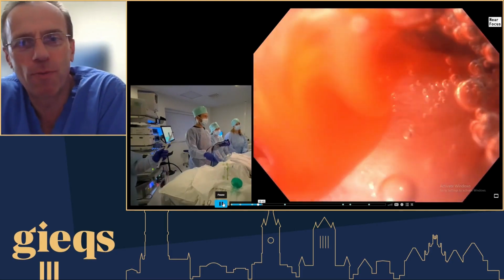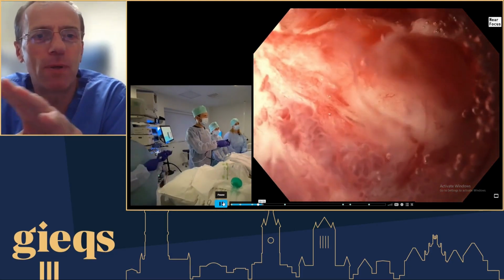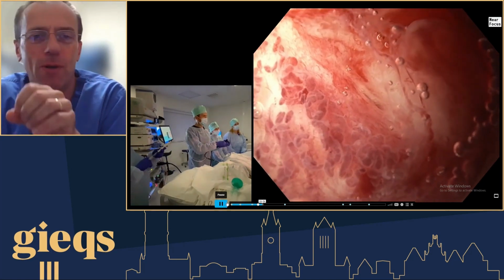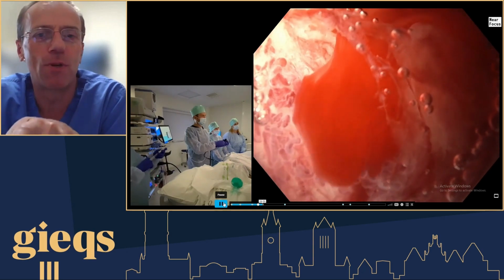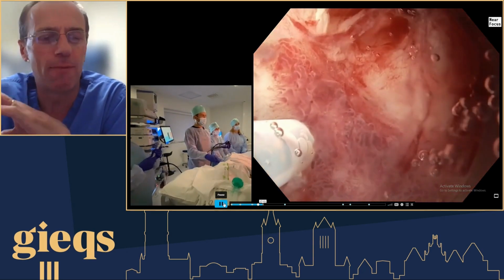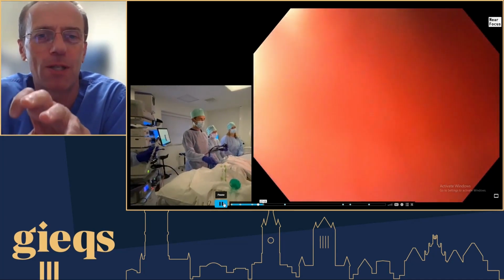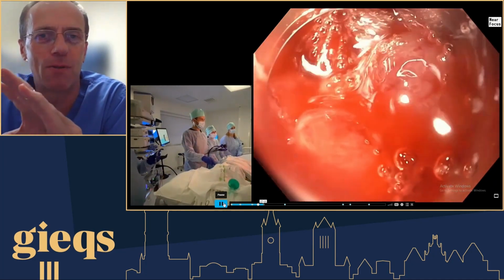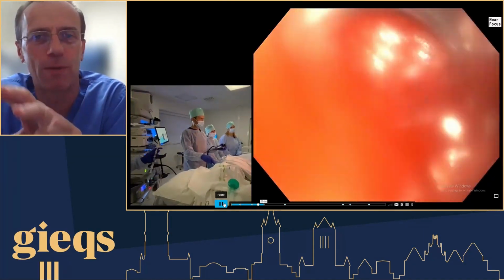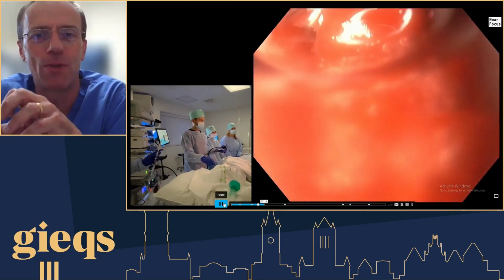We talk of the counsel of perfection. Look, we need to get this bleeding stopped. I like that. If we waste time trying to get an injection needle downstream or in the four quadrants, we need some adrenaline, we need some volume in here, and it will change the stigmata and it will improve the view. And if all else fails, spray the adrenaline onto the nearest point that you think is actively bleeding. Because I've seen so many trainees wasting time, and you're thinking that we're losing blood, trying to go for the counsel of perfection. This is all about hemostasis.